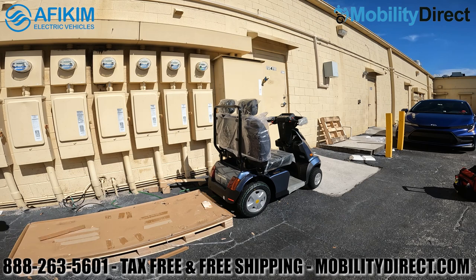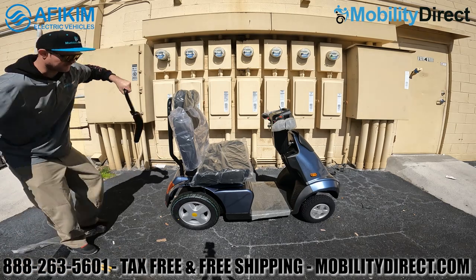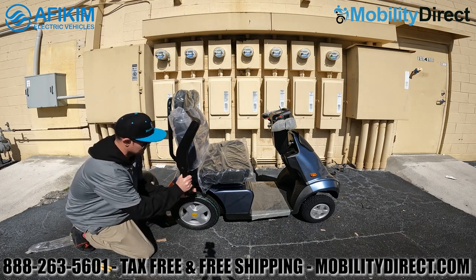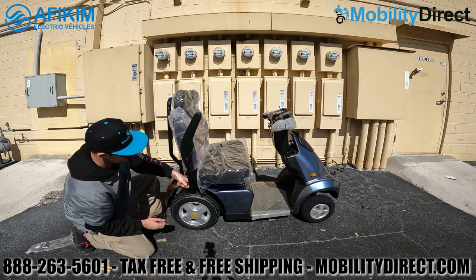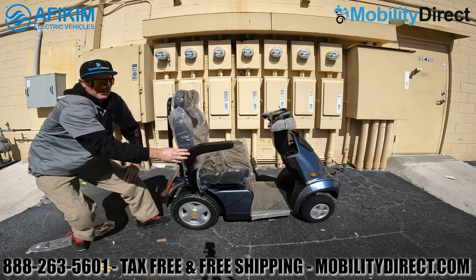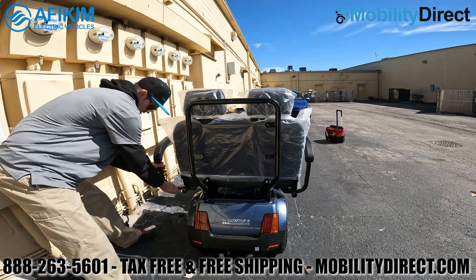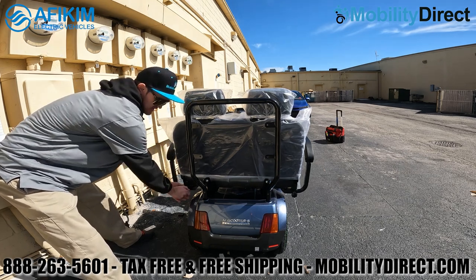There's really not much assembly required. You will need to install the armrests — just like most mobility scooters, the armrests have a sleeve that you slide the rail into. There are tension adjustment knobs in the back that you'll want to tighten once you have the armrests set at the desired width. You can adjust the width by sliding them inward or outward before tightening.